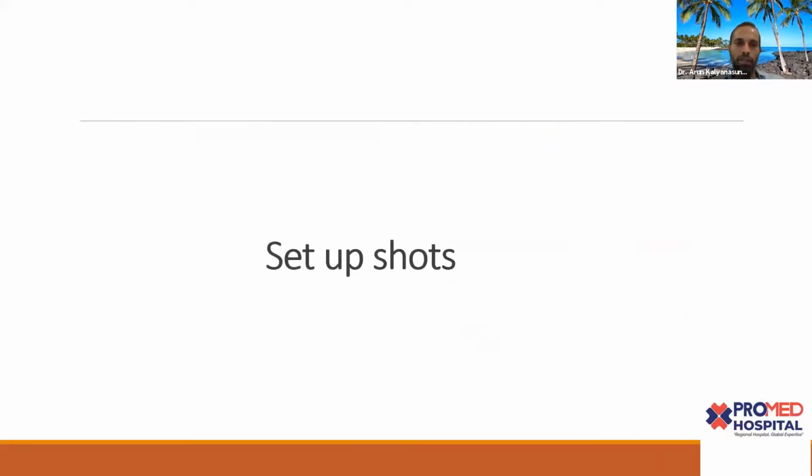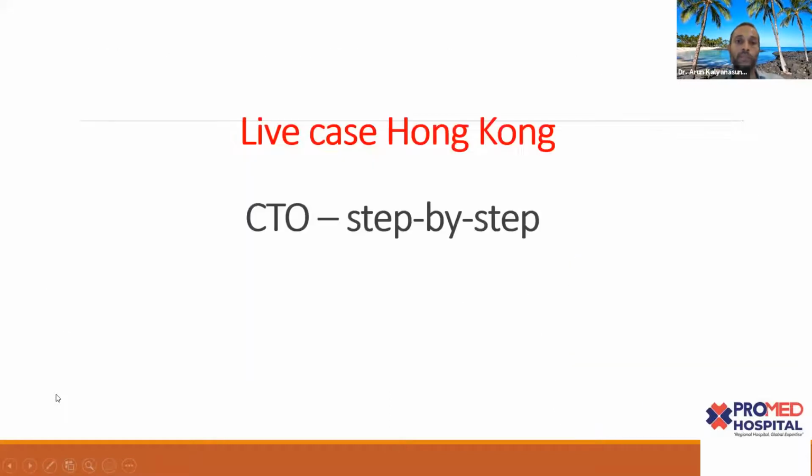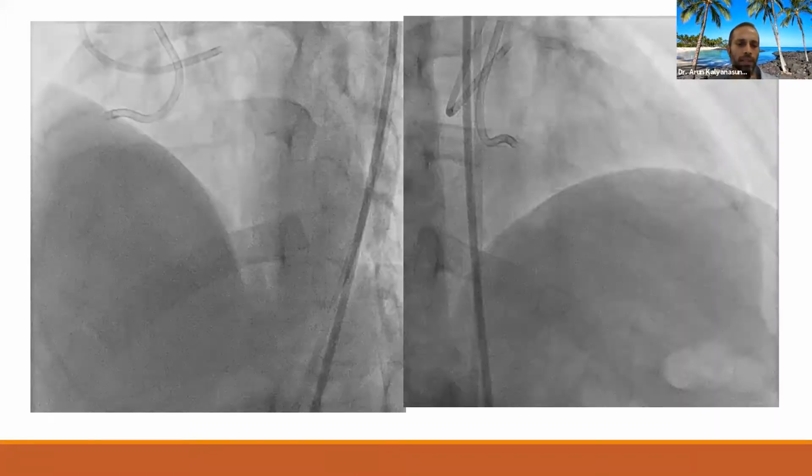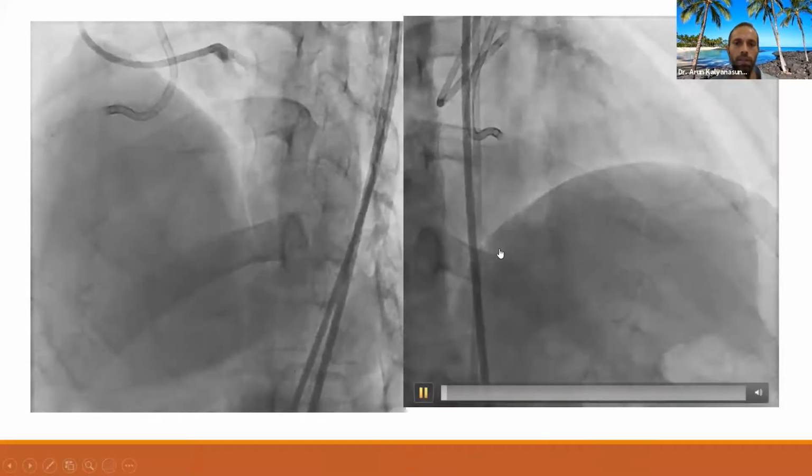So I'm going to show you a quick case. This was actually a case from 2 years ago when we were still traveling. This was a live case that I did in 2019 in Hong Kong, and this was the case that I got. I'm just going to let it play for a minute.